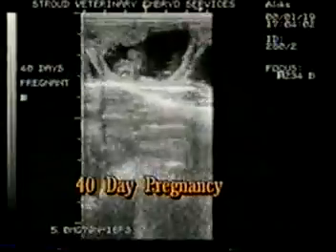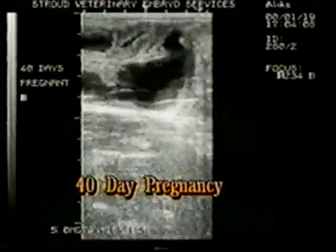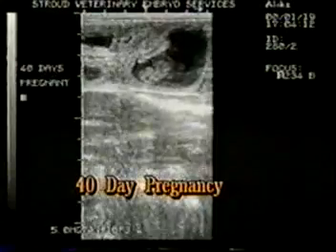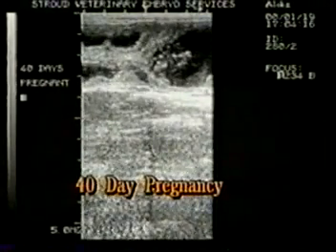Early pregnancy diagnosis can be very helpful for recipient or AI cow management. Although too early to diagnose sex, it is important to know if the fetus is healthy. This 40-day pregnancy has a viable fetus proven by the beating heart. Note the non-echogenic fetal fluids surrounding the fetus.